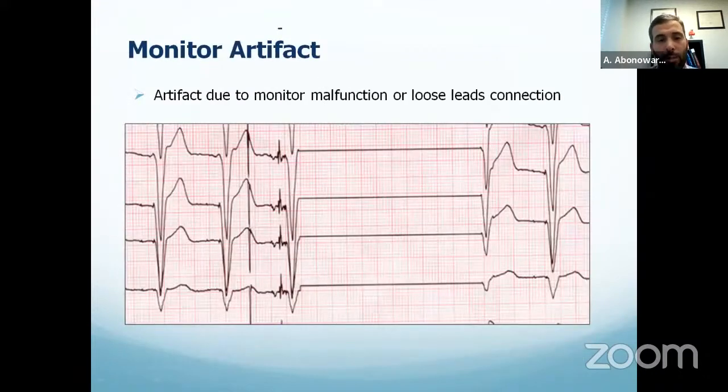Here, sometimes you see in the emergency room, if the patient moves and removes the ECG or monitored leads, that can cause an artifact like this. This is not a pacemaker problem. These are the monitor leads that were disconnected. So just make sure you did good alignment. This is an artifact and nothing alarming. And just repeat it and make sure that everything is good.